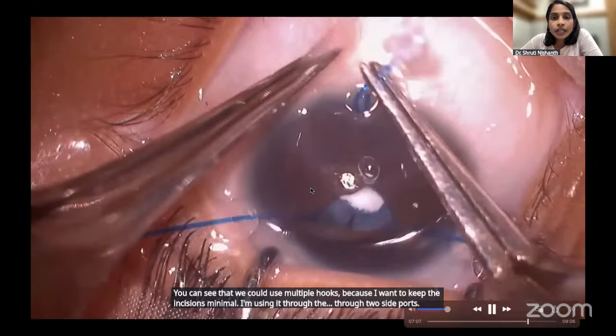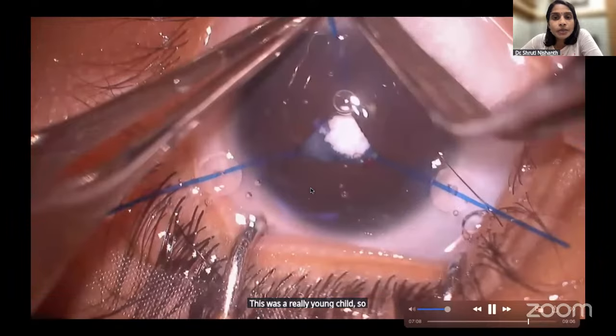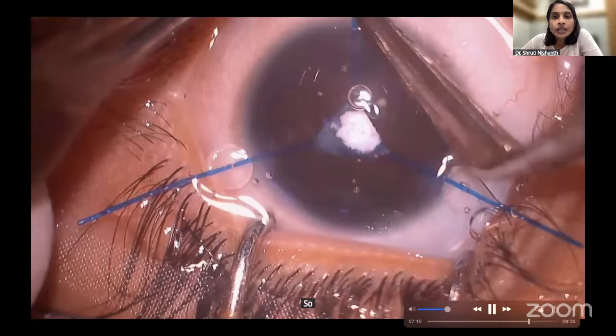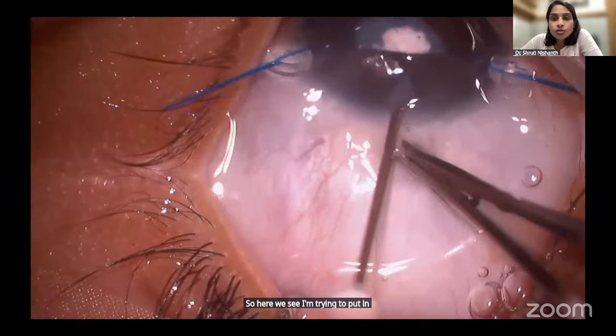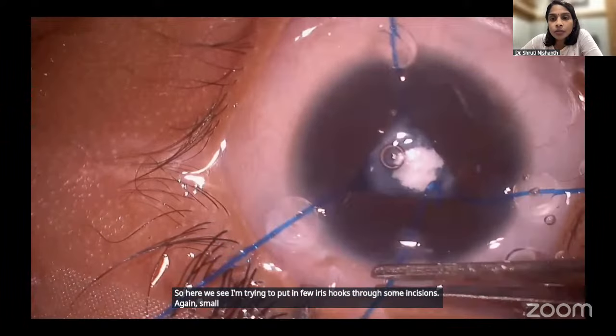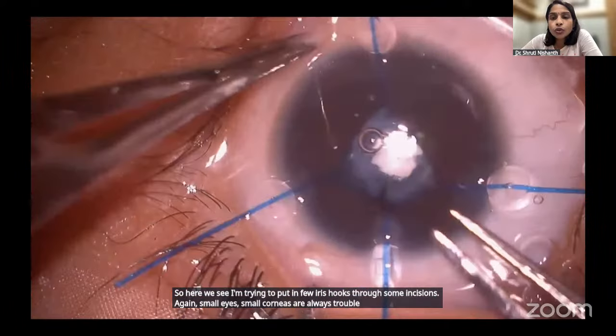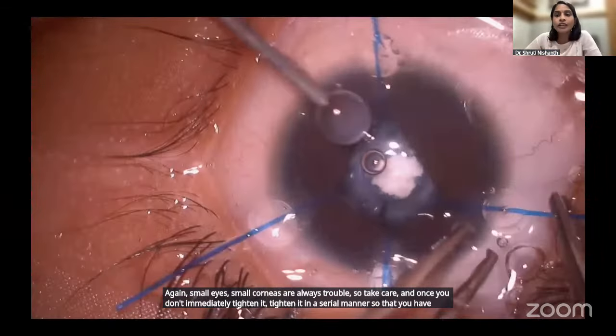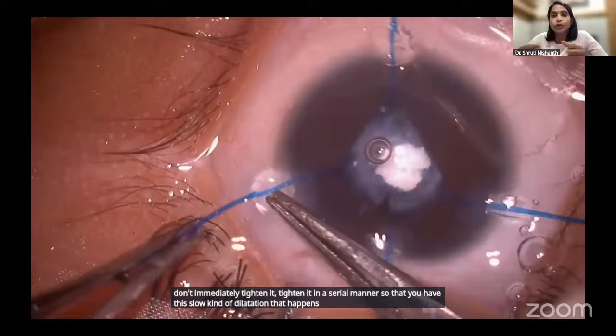This was a really young child, so I wanted to do a lensectomy and leave the child aphakic. So here we see I'm trying to put in a few iris hooks through some incisions. Again, small eyes, small corneas are always trouble. So take care, and don't immediately tighten it; tighten it in a serial manner so that you have a slow kind of dilatation rather than pure mechanical pressure.